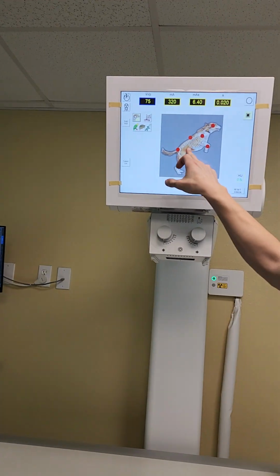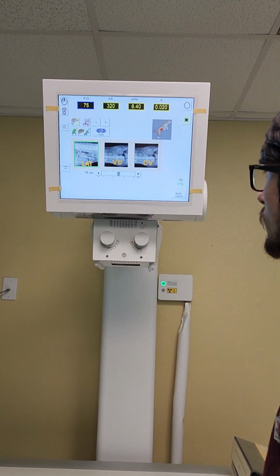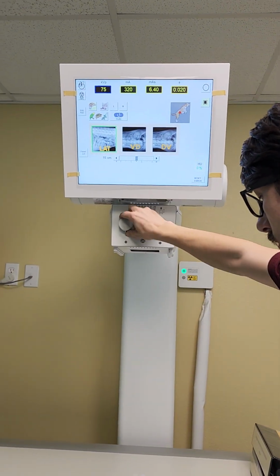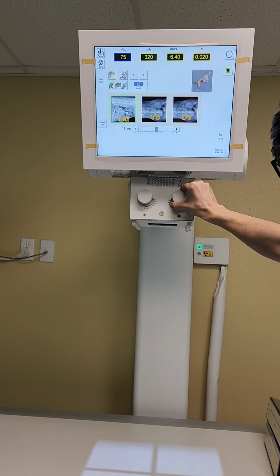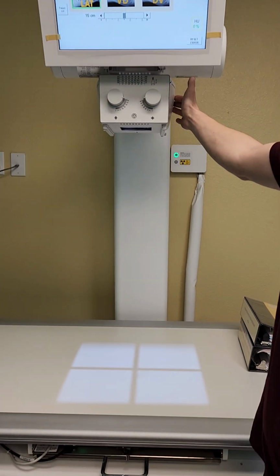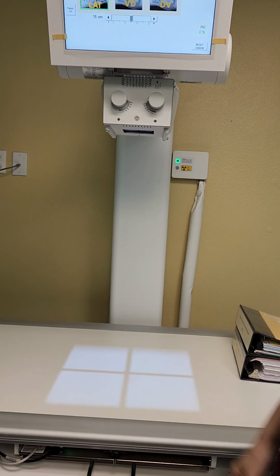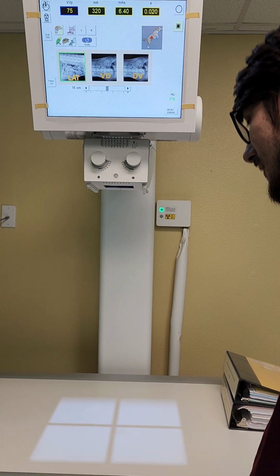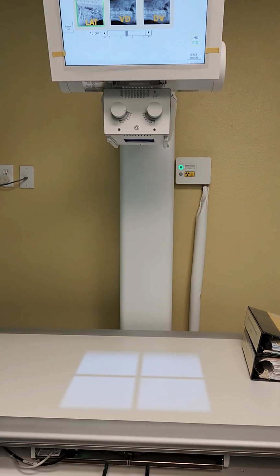So then select this one, lateral, whatever. You collimate however you need it to. It works. Isn't that beautiful? And it's, I believe, LED, so you don't have to replace the light bulb. It'll last a long time, and it's bright. That's why I like them.